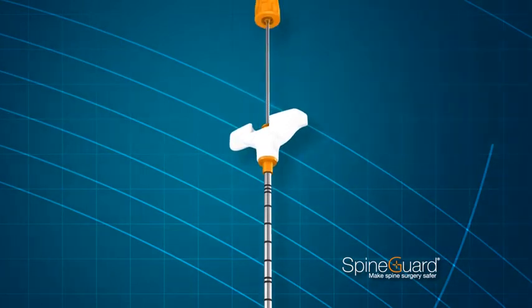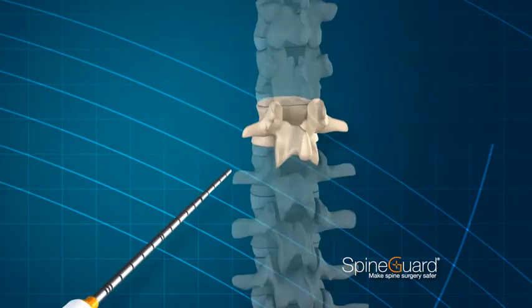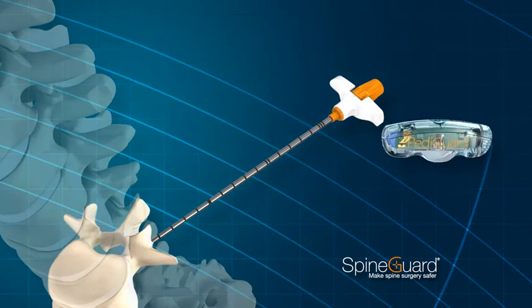By measuring the local electrical conductivity of the bone tissue at its tip five times per second, PediGuard can alert you before you breach in all planes.